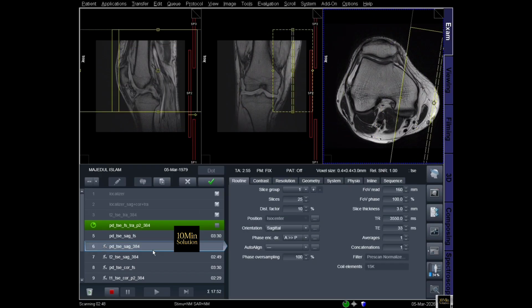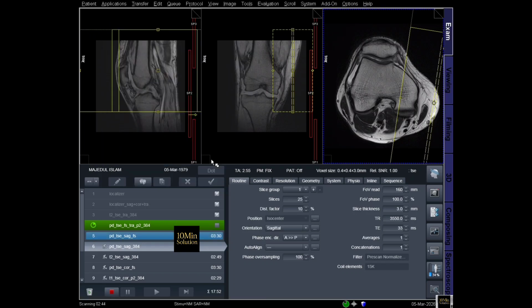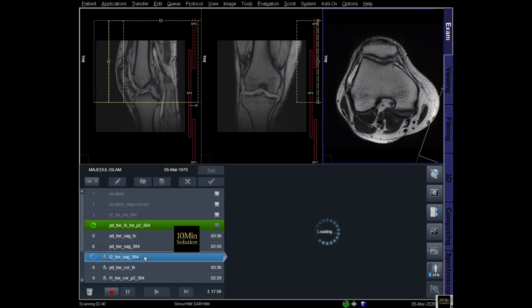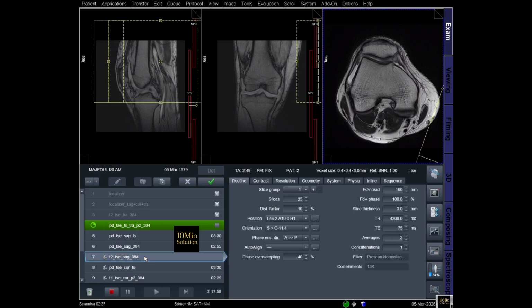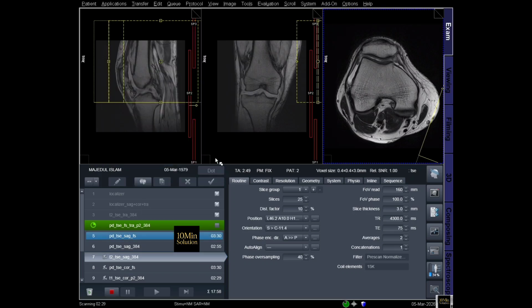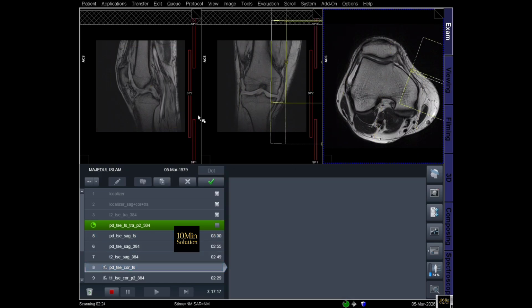Axial plane planning. The axial plane is planned perpendicular to the long axis of the femur and patella, using sagittal or coronal images as reference. Axial images provide detailed visualization of the patellofemoral joint, retinacula, quadriceps tendon, patellar tendon, and surrounding soft tissues.